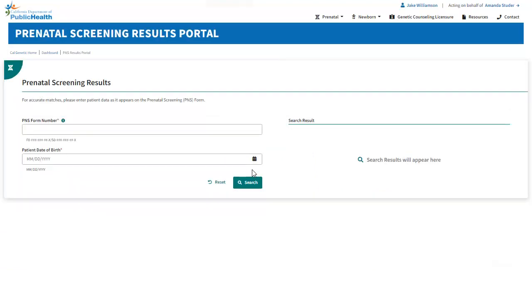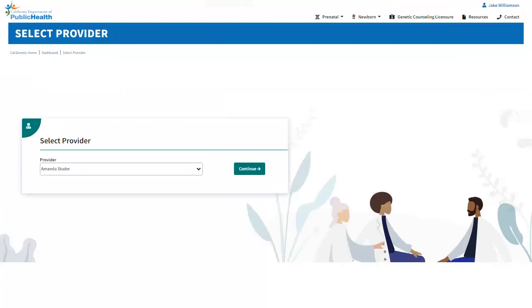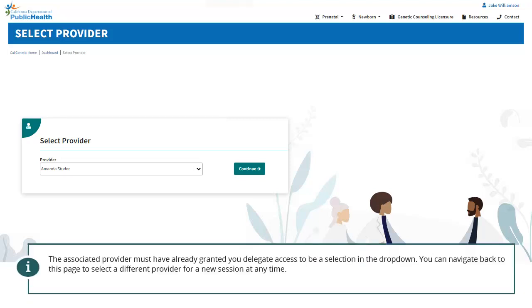To work as a delegate with a different provider, click the clinician's name that you are currently acting on behalf of. You will be redirected to the Select Provider page to select a different provider to work with as a delegate. The associated provider must have already granted you delegate access to be a selection in the drop-down. You can navigate back to this page to select a different provider for a new session at any time.